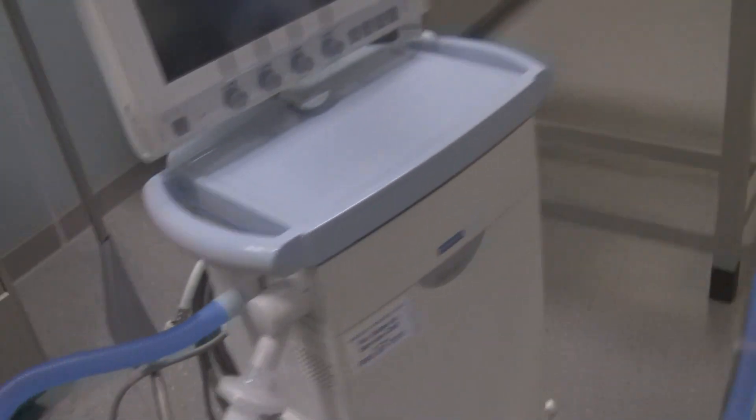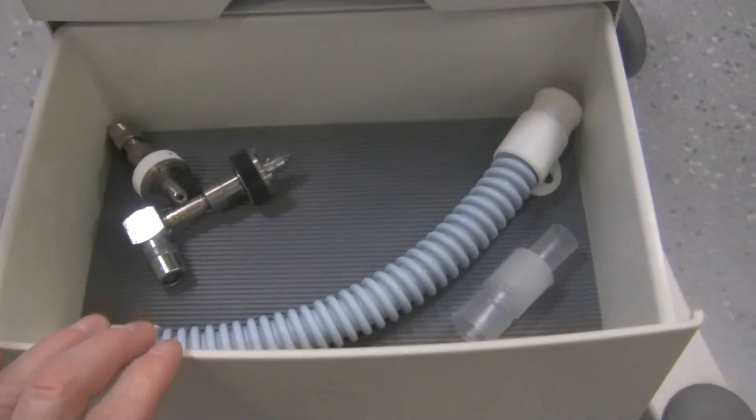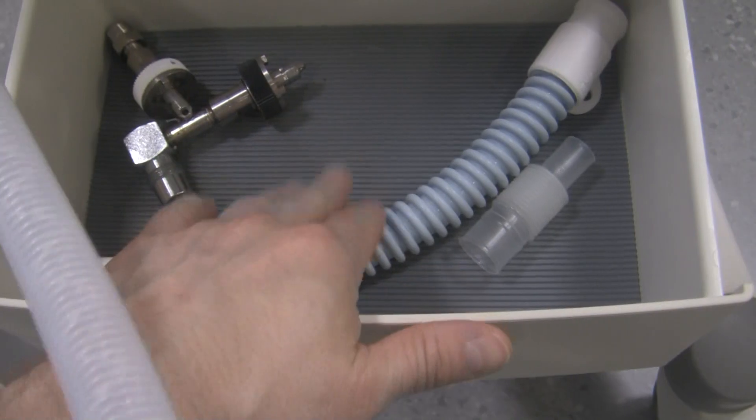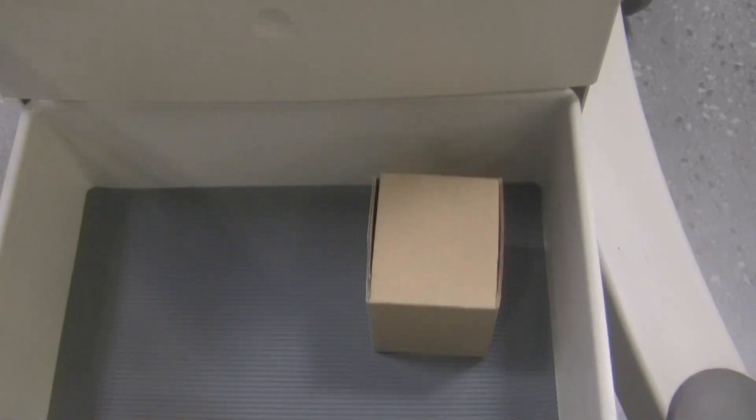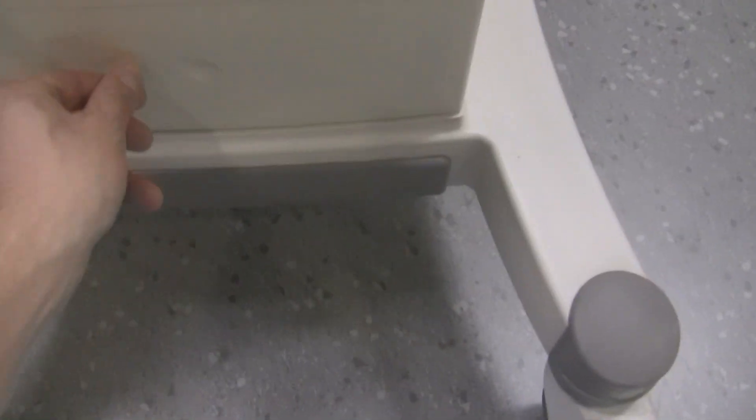Going back to the front of the ventilator, there are a couple of doors down here. If you push this one, it's a storage area — that's where you'll find things like the connector for doing the pre-use check on the ventilator, extra supplies, etc. There's another drawer at the bottom; you just push it open and push it in to close it. There are wheels, and it's a good idea to make sure you lock them when using the ventilator so it's not going to go anywhere.